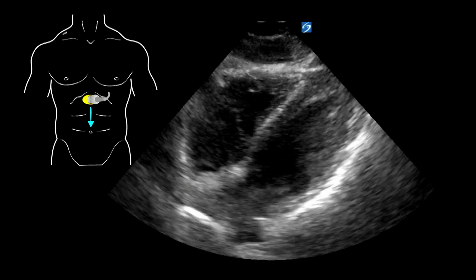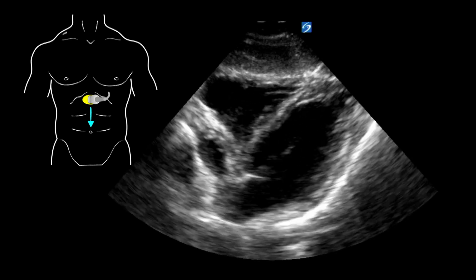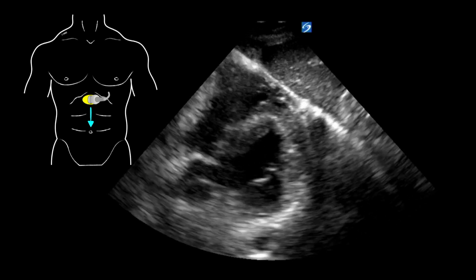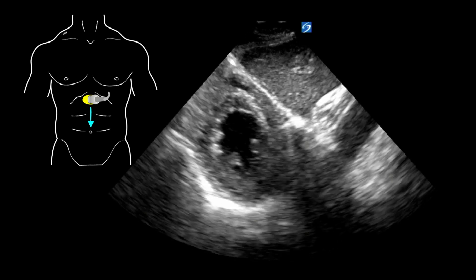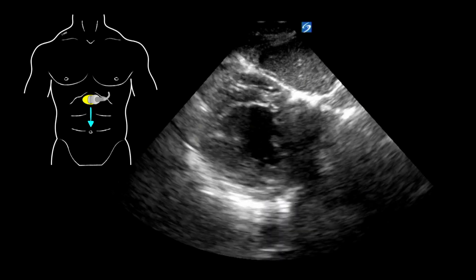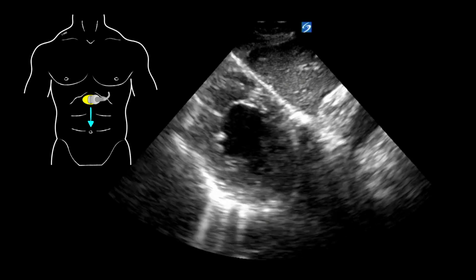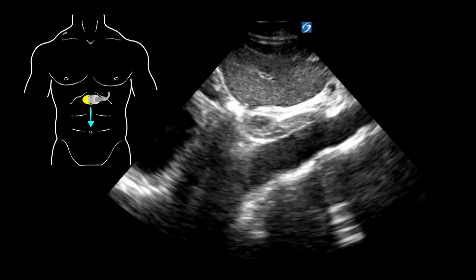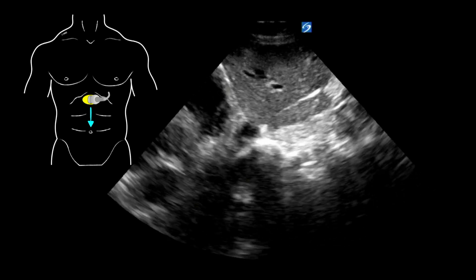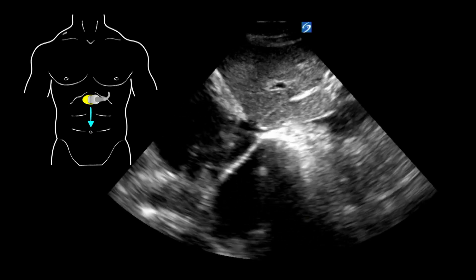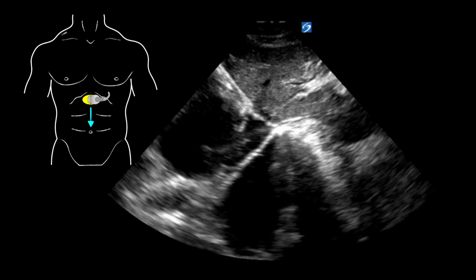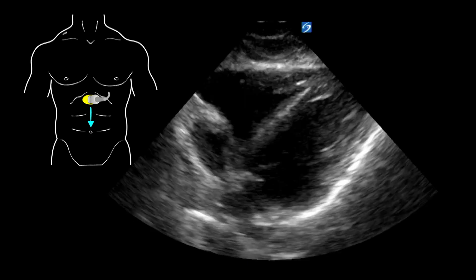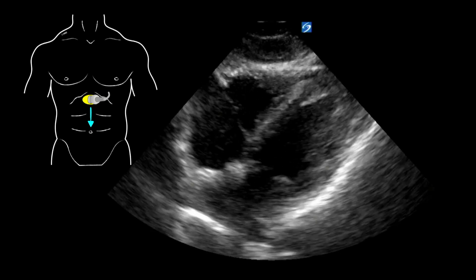Once again, we have a four-chamber view of the heart. We're going to start to rotate the probe and see the mitral valve in the middle of the screen, then fan to the papillary muscles. Then we're going to start to angle down towards the umbilicus. We'll see the aorta come into view, then fan towards the right — and here we see the IVC. In this patient, it's very compressible.